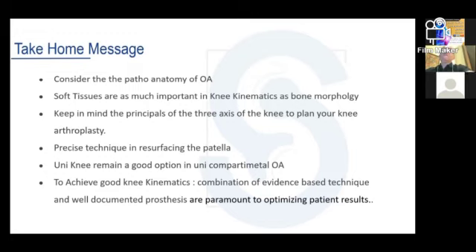We resurface the patella in rheumatoid patients in all cases, for example, because it's an inflammatory disease that will change with time and they are always painful. There is almost a synovectomy of all the synovial tissue all around.